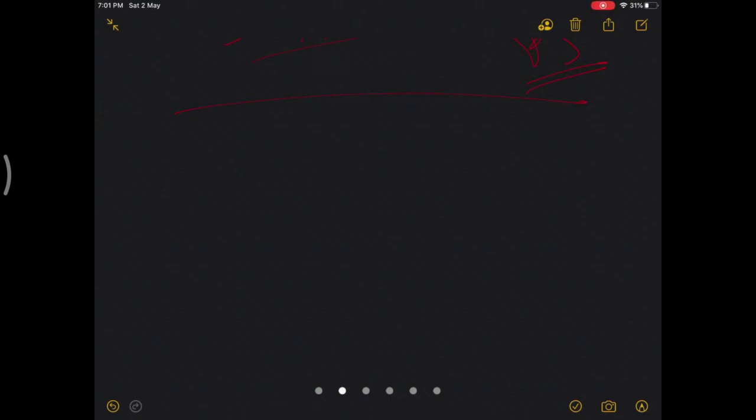Another thing which differs between PS and CR is that PS is more constrained, and the rollback is because of the cam and post. This cam touches the post at around 60 to 70 degrees, and this prevents the anterior translation of the femur.